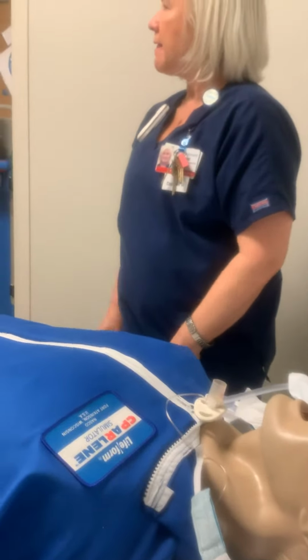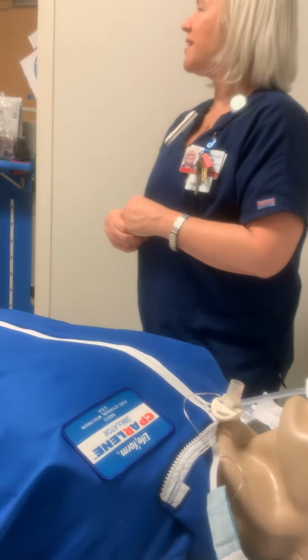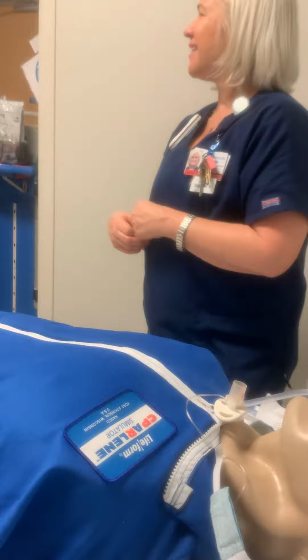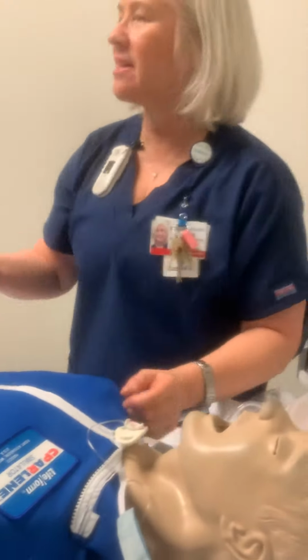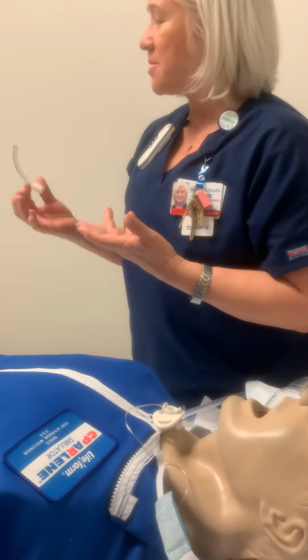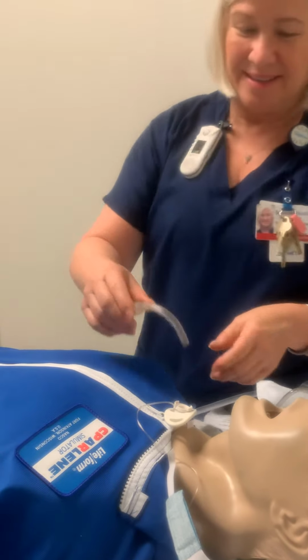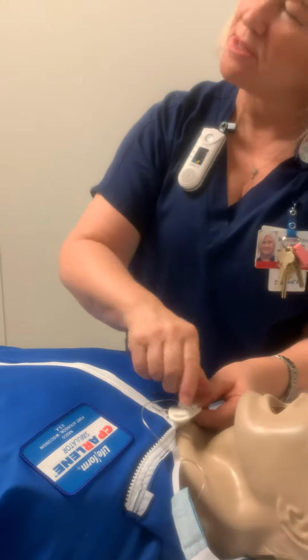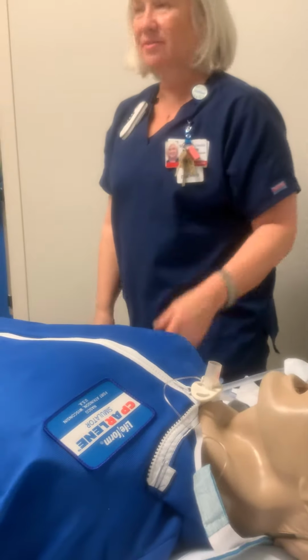Cleaning that inner cannula always got to me more than the actual suction. Really? I don't know what it was, I was looking at it and it was crusty, you know, a weird thing. But if it's disposable, then you don't even clean it. You just throw it away. Okay. And I prefer the disposable ones because I don't like cleaning them. Yeah. I just prefer to throw them away and get a new one. Exactly. And that's pretty much most trachs, but then some of them you do have to clean.